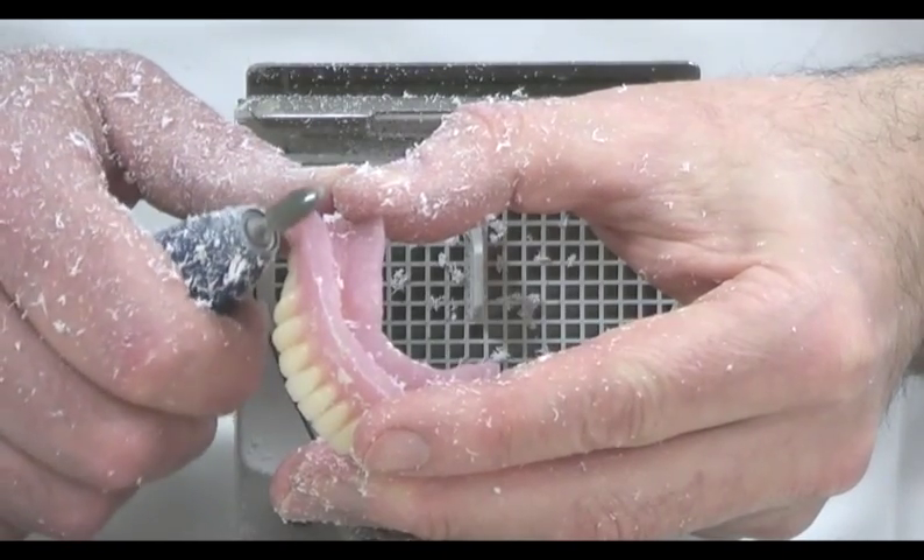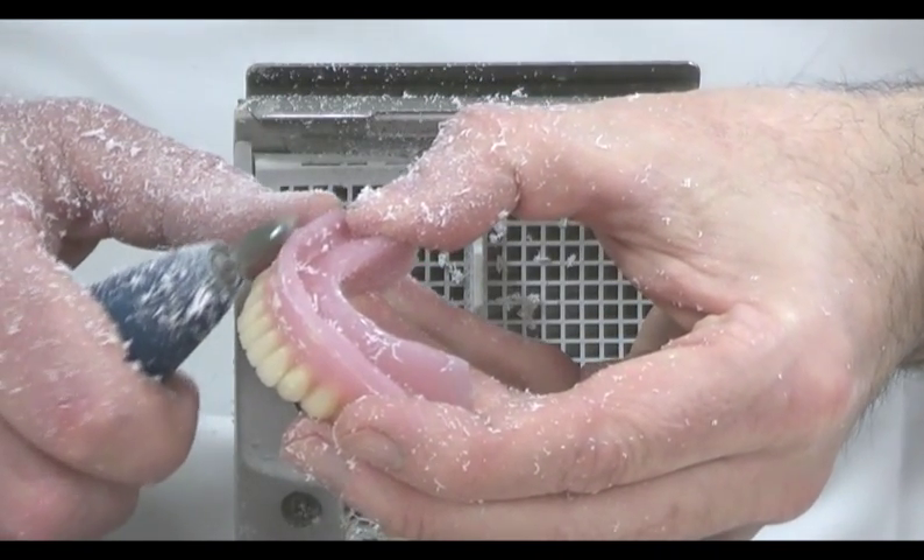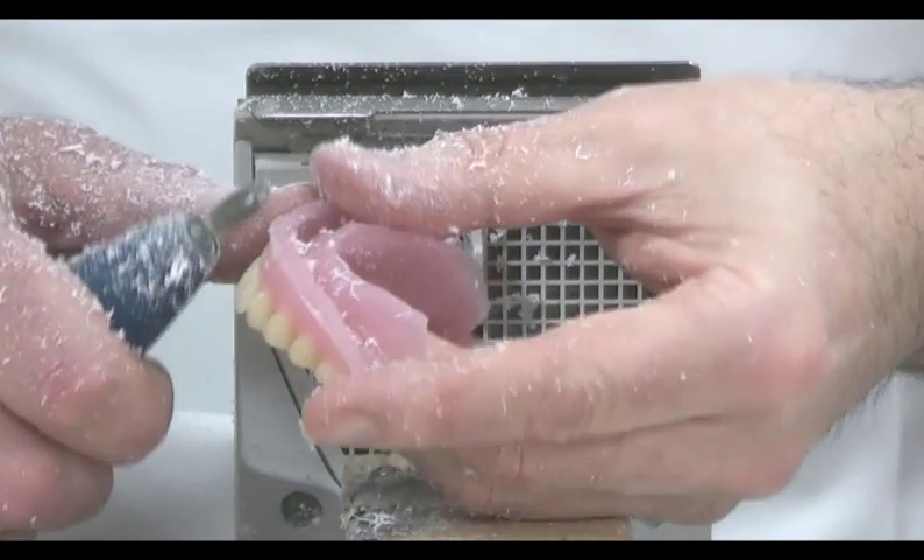Once the flash has been fully removed, we cycle through the various grades of burr to smooth and contour the surface of the denture, taking time to round off the sulcus edges.